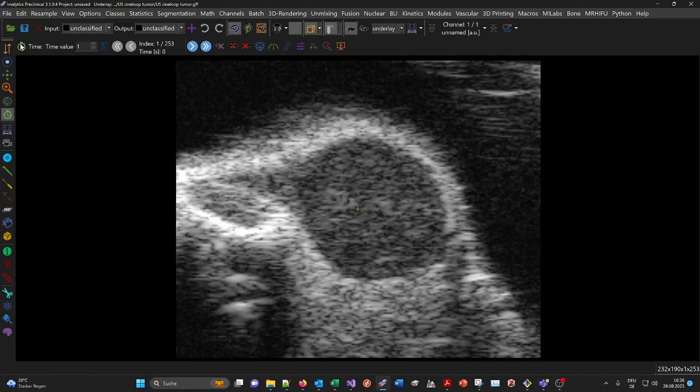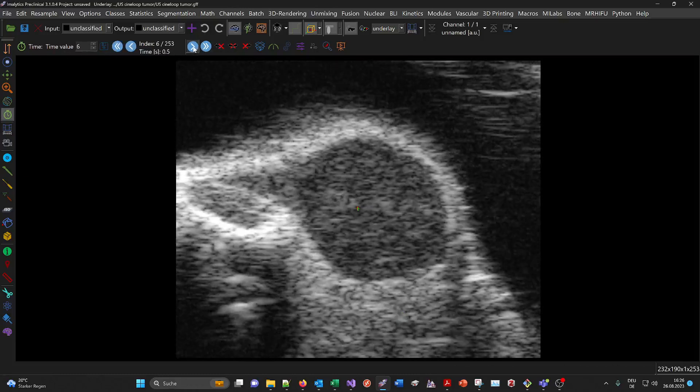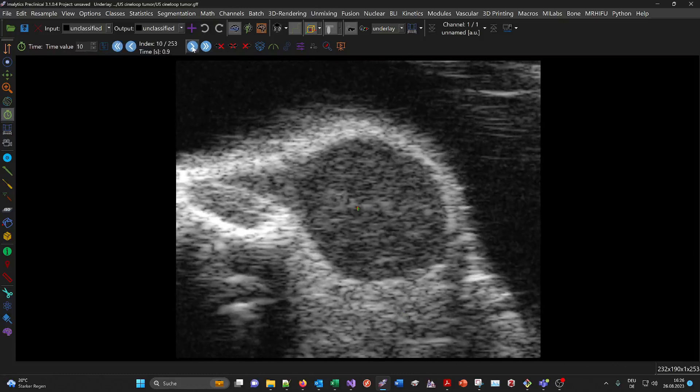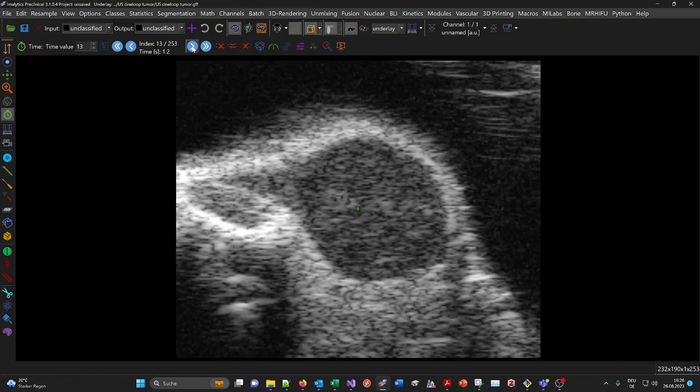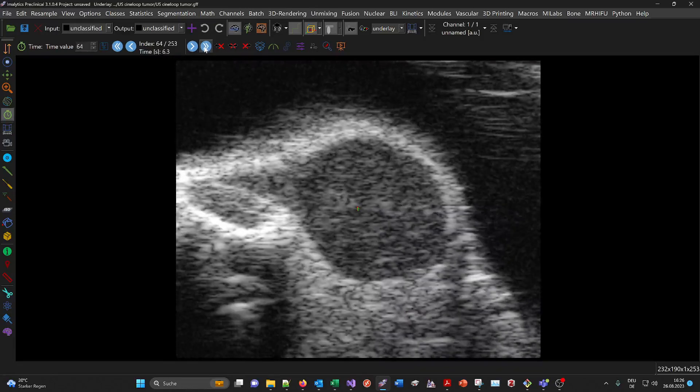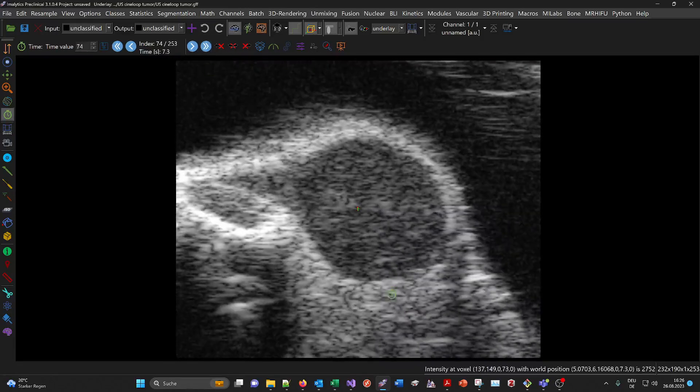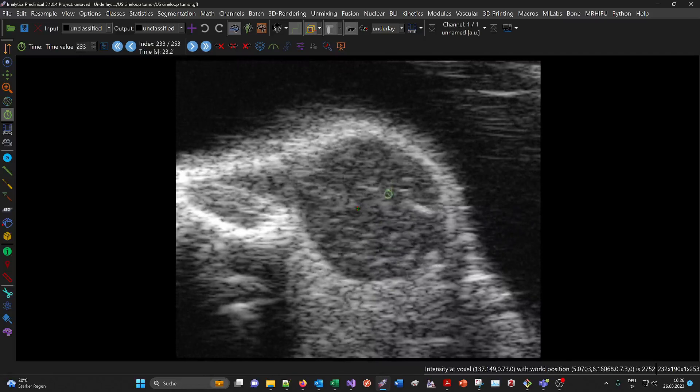This toolbar belongs to the time mouse mode. There you can see where you are in time. You can go through slowly slice by slice, time point by time point, or in larger steps, or with the mouse by clicking and dragging.